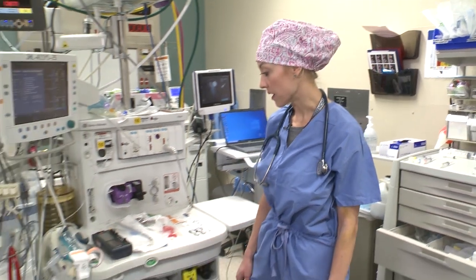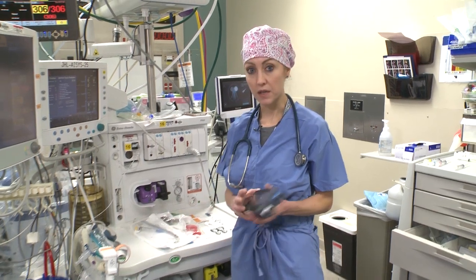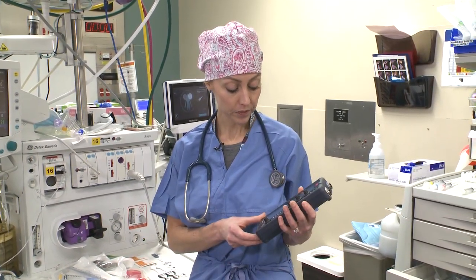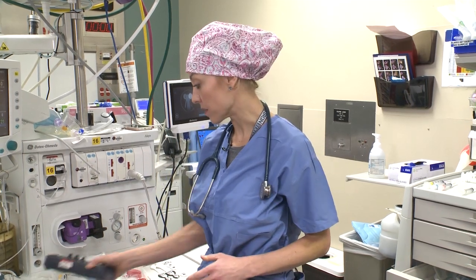We're going to get started over on our ventilator. First thing I want you to make sure you have set up in the morning is to always have a pacer box here and ready to go. Turn it on up top, make sure you have a full battery, and then you can turn that off. Make sure you always have a pacer box.